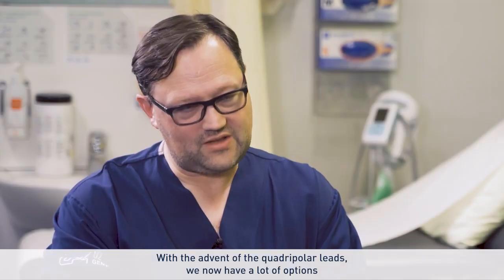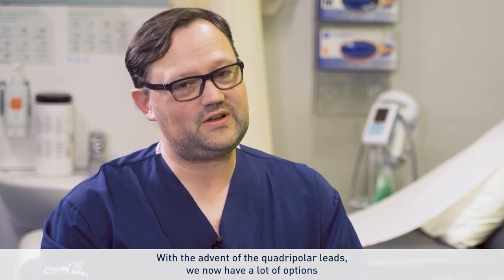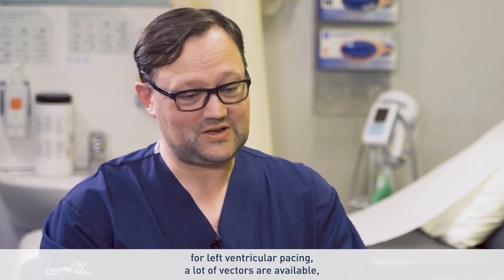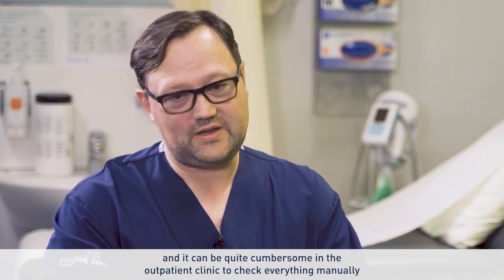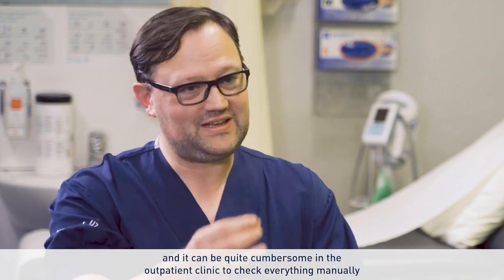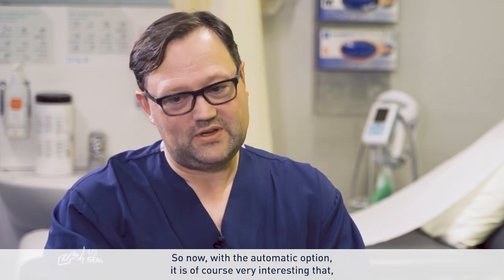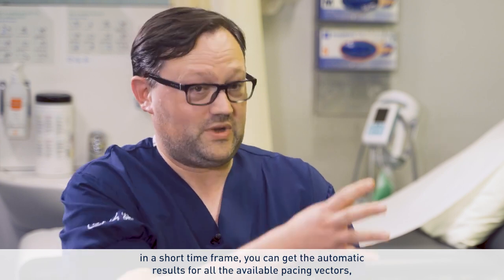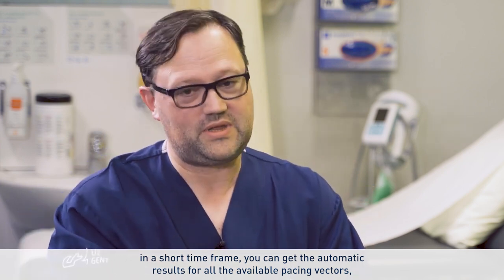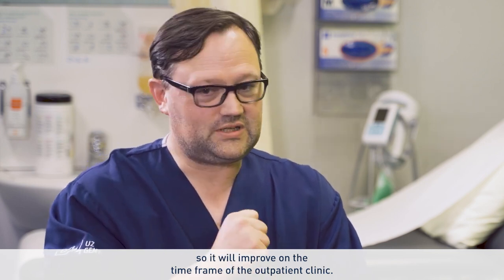With the advent of the quadripolar leads, we now have a lot of options for left ventricular pacing. A lot of vectors are available, and it can be quite cumbersome in the outpatient clinic to check everything manually and to find out which one is the best for the individual patient. So now with the automatic option, of course, it's very interesting that in a short time frame you can get the automatic results for all the available pacing vectors. So it will improve on the time frame of the outpatient clinic.